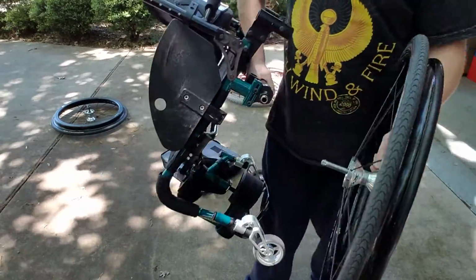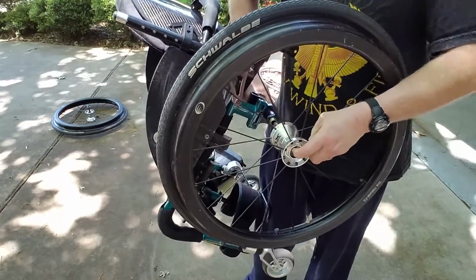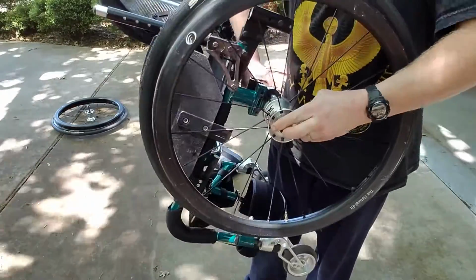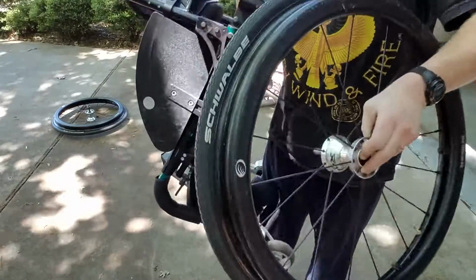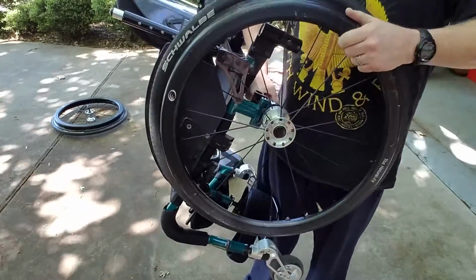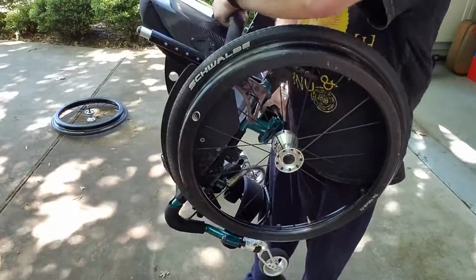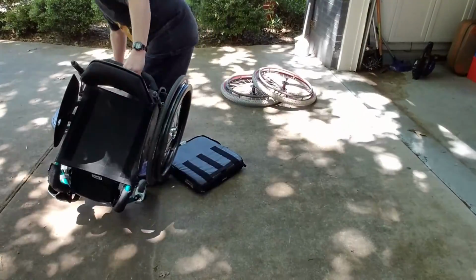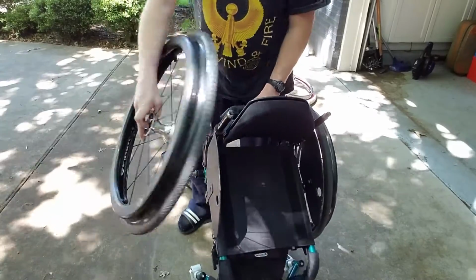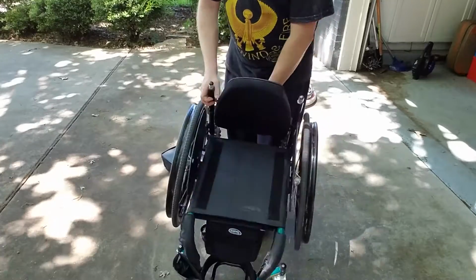So all you do is just take it, push the button, and then whoop. Kind of hard to do it while I'm holding it. Just slide it in, and now it won't come out. You do the same with the other one. Push the button, and just slide it in, and now you're in business.